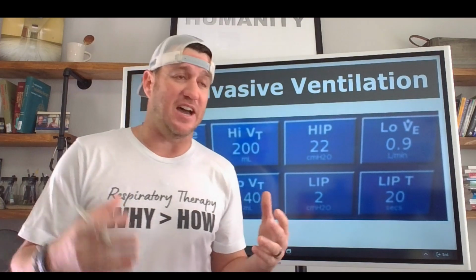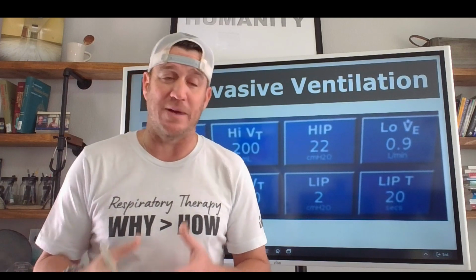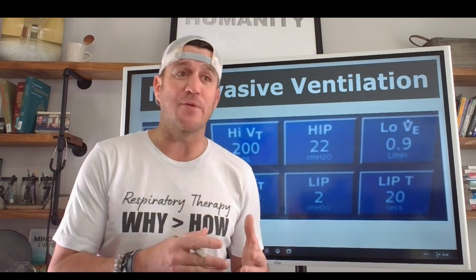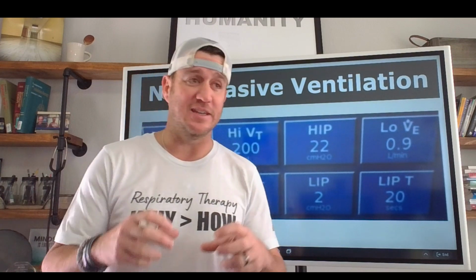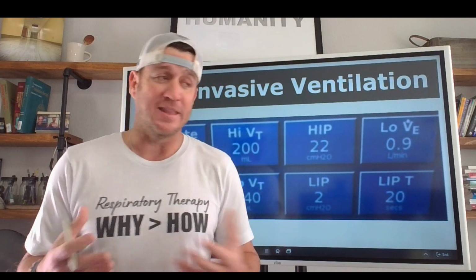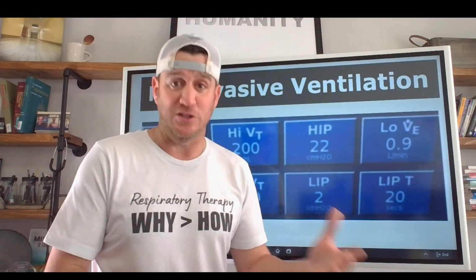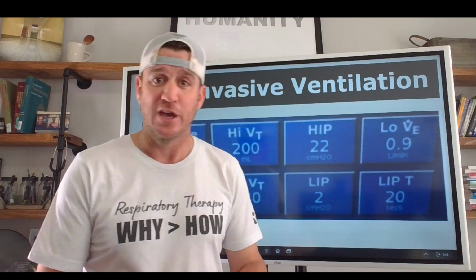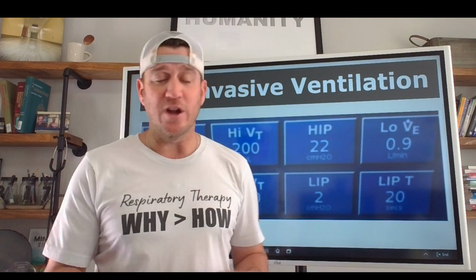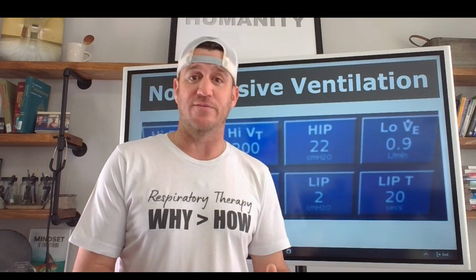So let's say that the tidal volumes are ranging again 300 to 550, then I would probably set my high tidal volume alarm somewhere around 700. And that would let me know if something excessive was to start to cause this patient to breathe too high. Now, the other problem with this is we are providing positive pressure therapy to our patient. It's just non-invasive. So remember, volutrauma is a thing. So we don't want our patients sitting there taking 900, 1100 ml tidal volumes.